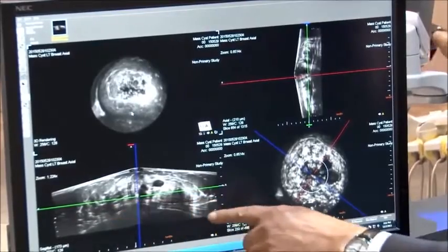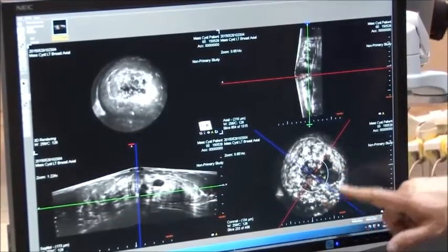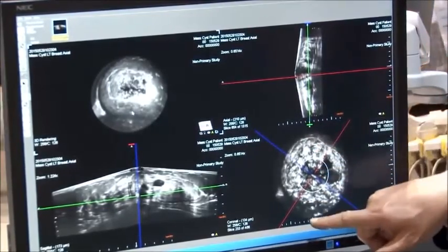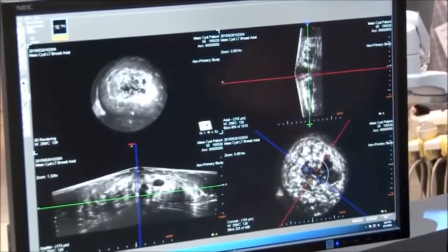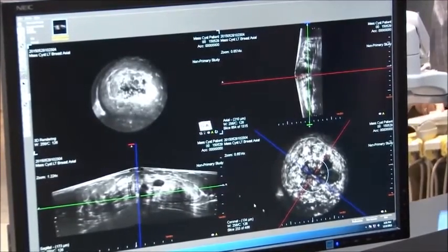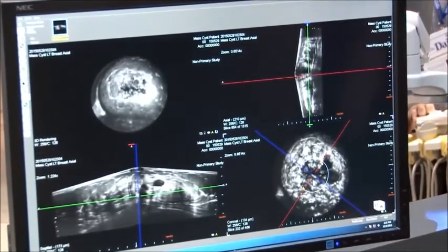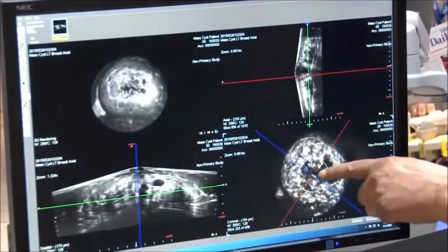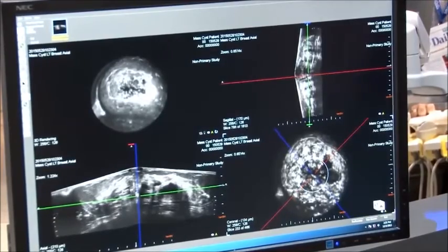This is the axial slice, and that's what you use for the purposes of diagnosis. And the coronal slice gives you positional data. So it always tells you that you're at 12, 3, 6, 9, so that the radiologist is always oriented to what they're looking at in the breast. And then we've made it very simple. Because we acquired the data in a radial format, we want you to review in a radial format. And if you'll notice here, you'll see the structures moving and you'll see our position moving here. And this is how you would survey a breast.